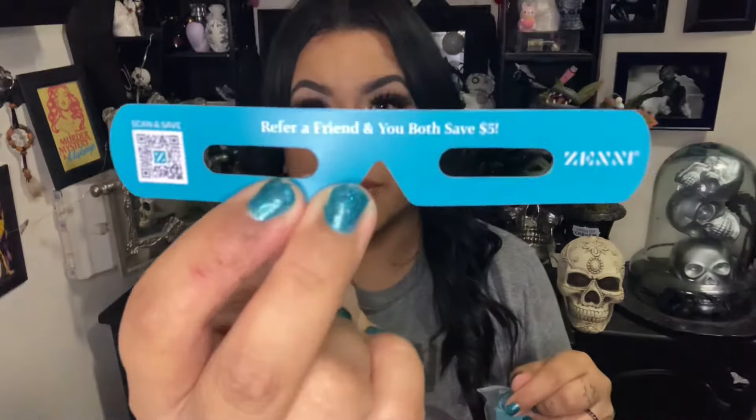It came with a little beautiful turquoise case and this little card that says 'Refer a Friend' — you both save $5. I bought this with my own money. It comes with a little baggie with instructions, and it was beautifully wrapped with a little cloth.